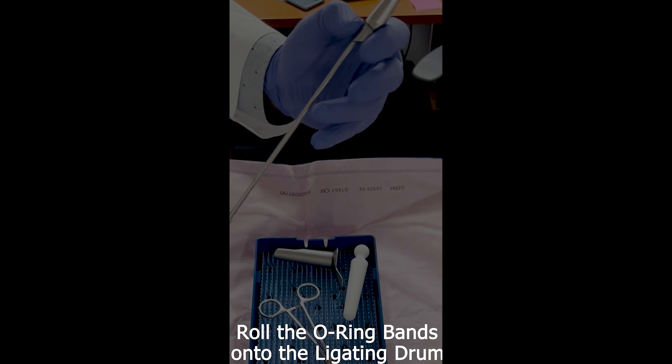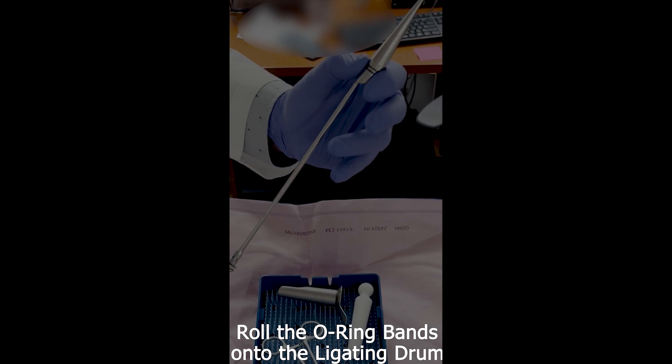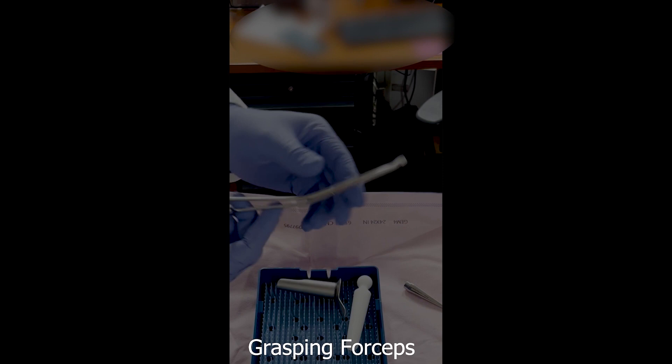We prefer to place two bands, however you may elect to use only one. You can apply up to three bands at the same setting, however placing multiple bands may increase pain, urinary retention, and vasovagal reactions. Remove the loading cone — the rubber band ligator is now ready to be used.